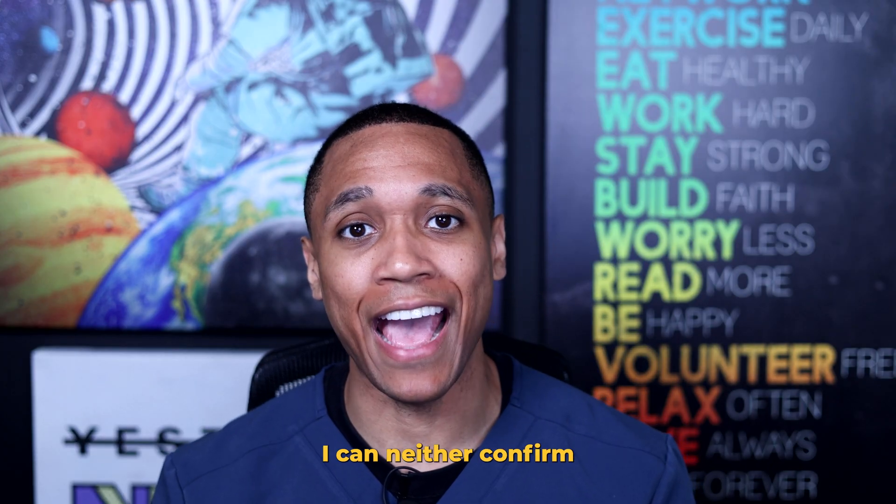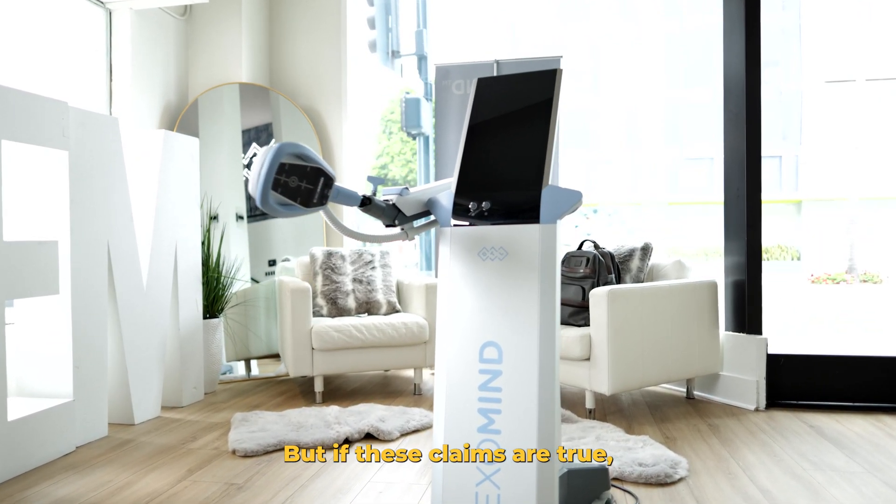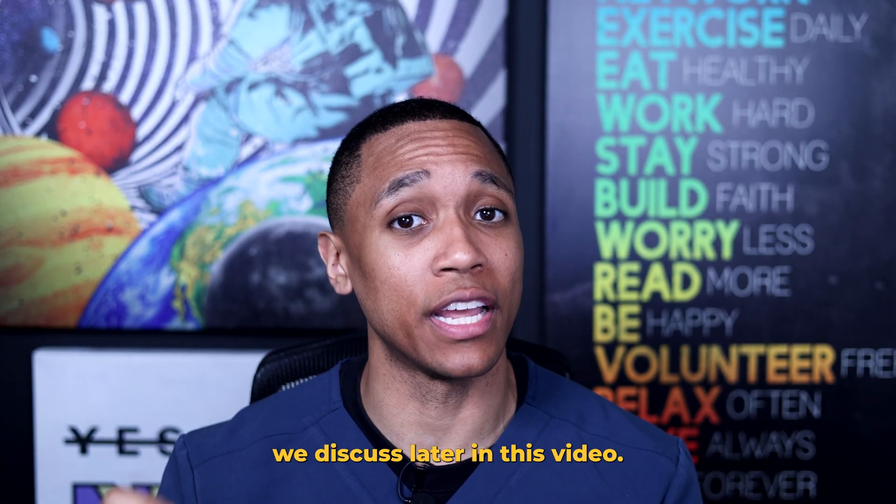Now because this is a new machine, I can neither confirm nor deny these claims. But if these claims are true, these three things are going to be very important for what we discuss later in this video.